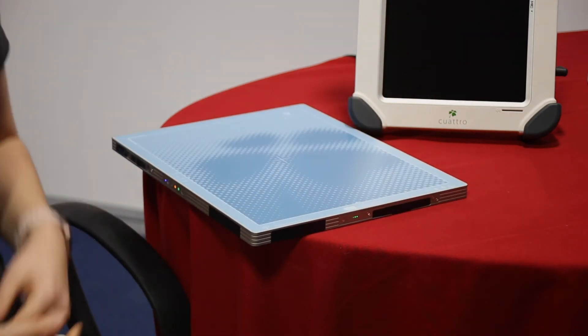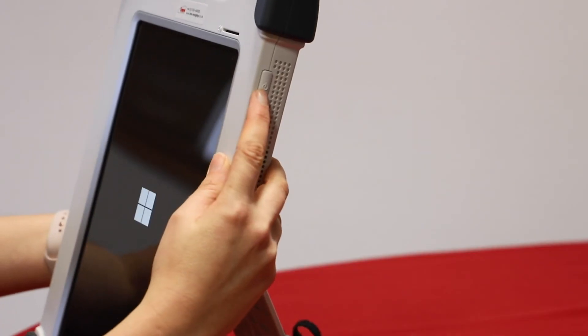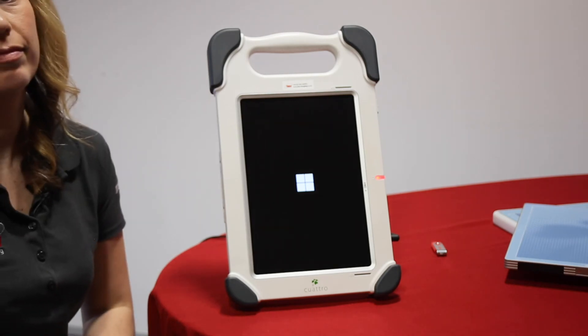Once the plate's been on for about a minute and a half, turn the tablet on. There's a button on the side. Press and hold until it starts up.